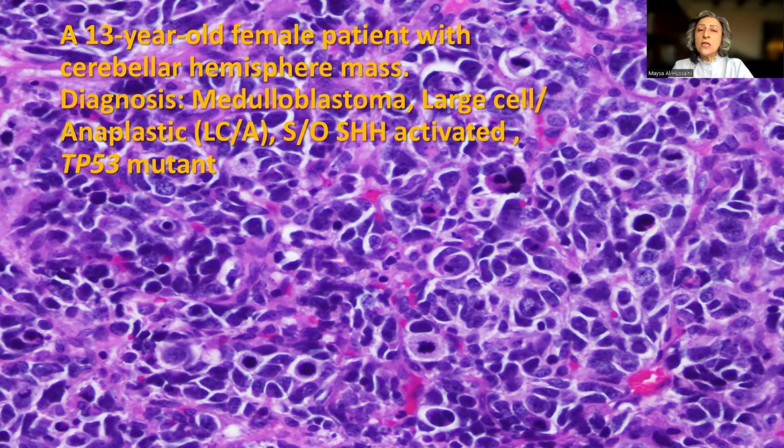So morphology is important, immunohistochemistry is important, especially if you're reporting in neuro-oncology. You have to acquire these three stains: beta-catenin, and you have to know how to interpret it; Filamin-A, a really robust immunohistochemistry that can be easily produced at your lab; and then the P53 immunohistochemistry.